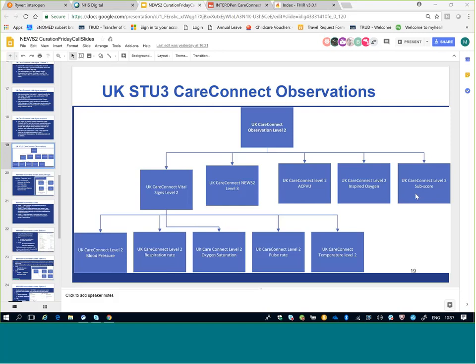It's consistent, obviously, with US Core, but I don't see the point of it for the UK because we're not going to be using it. Well, I think they haven't given us much of an option, to be honest. It's not US Core, it's the base FHIR specification. The vital signs profiles are not part of US Core. They were originally defined in Argonaut for STU 2, but in STU 3 they're now part of the base profile specification. So, yes, we investigated that, and we would love to dispense with LOINC codes, but we can't, because to be conformant to the base STU 3, we have to use them. Well, we only have to use 13 LOINC codes.